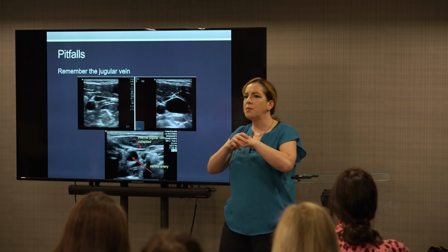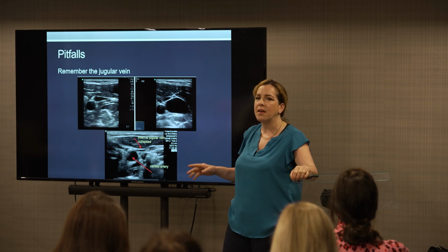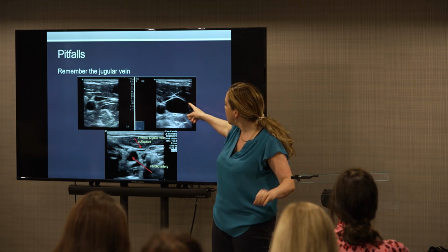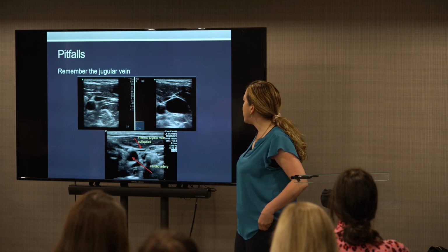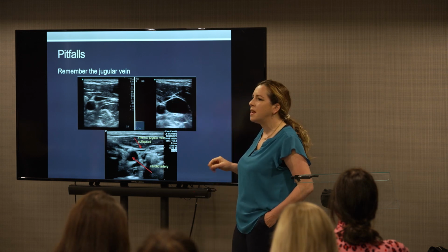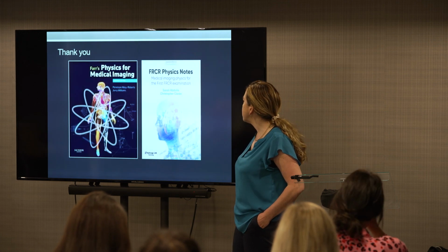So make sure you know where it is. Get the patient to Valsalva before you stick the needle anywhere in that vicinity. And then on a Valsalva, it would blow up like this. That's just word of advice. As I say, it doesn't seem to matter with a very thin needle, but I wouldn't want to stick a core biopsy through it. Next slide.